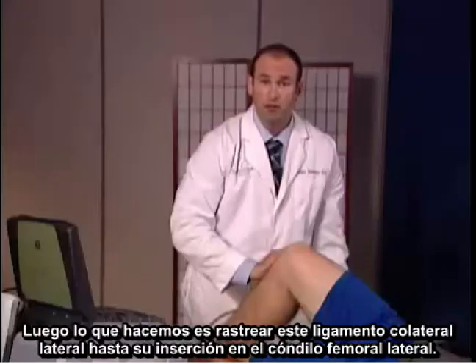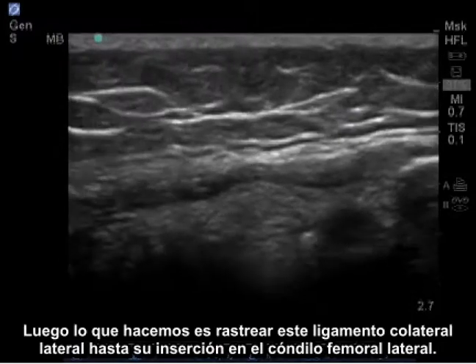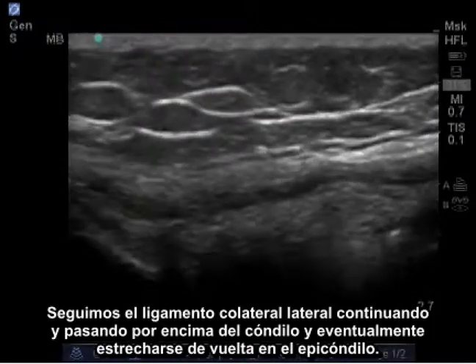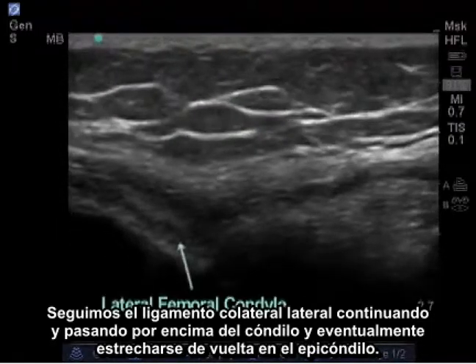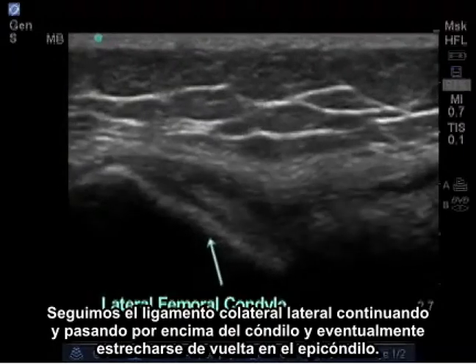Next, what we do is trace this lateral collateral ligament up to its attachment on the lateral femoral condyle. We follow the lateral collateral ligament as it continues to pass above the condyle, and eventually it will taper back onto the epicondyle.